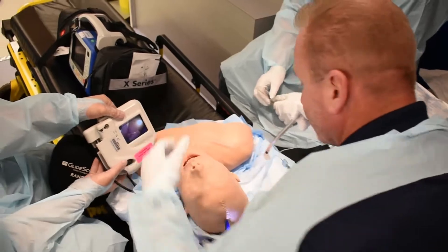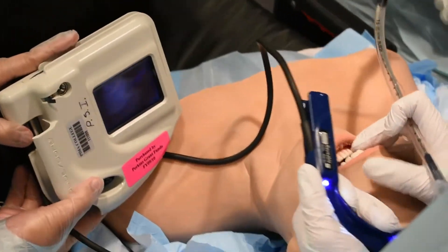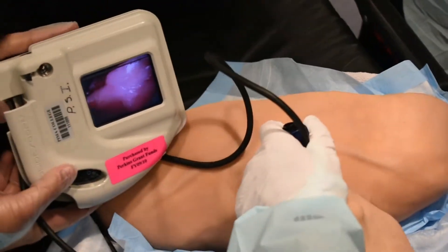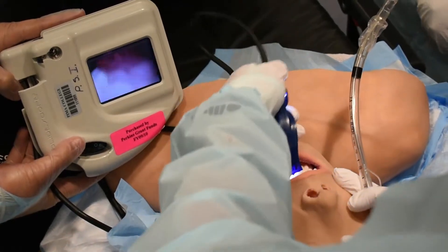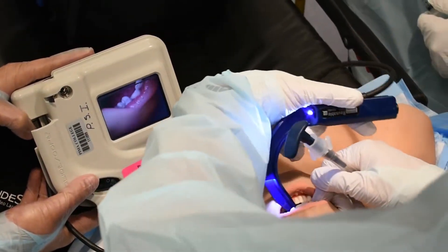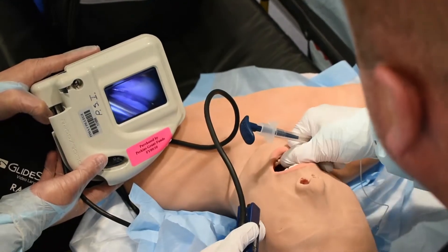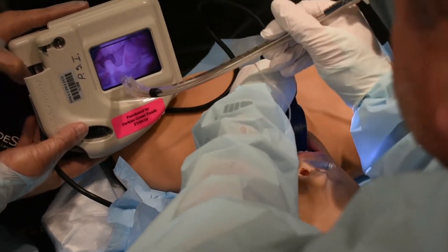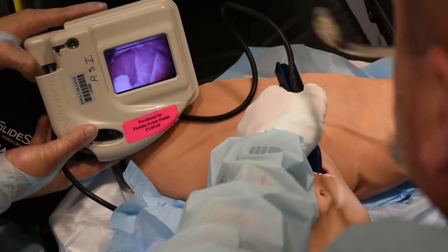Get your patient in position. The most common error with the Ranger is people will take it and just ram it all the way down, then say they can't see anything — that means you've buried your Ranger way too far. You actually follow the camera as you go in. As soon as it's through the mouth, I do the scissor lift technique to open the mouth — opposing thumb and index finger — rather than ramming it open and breaking teeth. I put the blade just right of center and start coming down. There's the uvula pointing north; there's the tongue with the taste buds. I'm just walking my blade down.